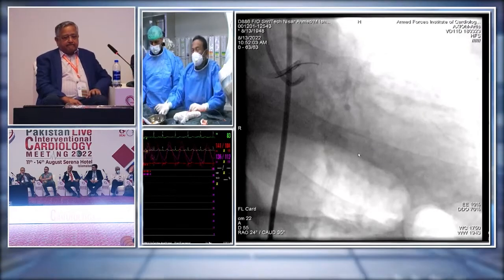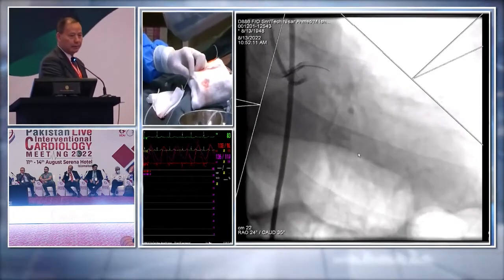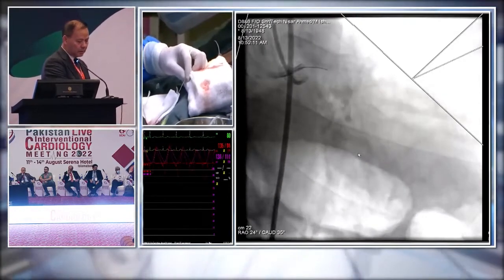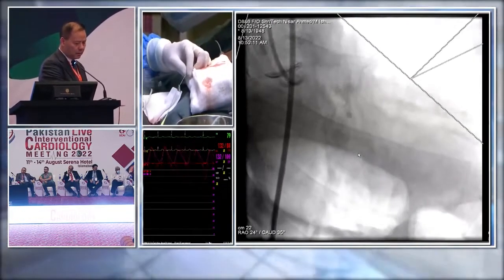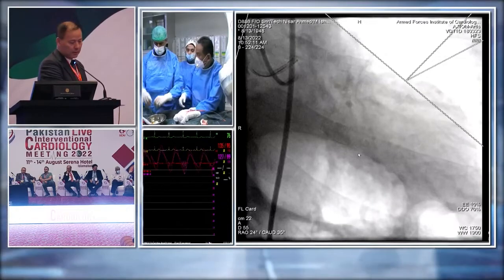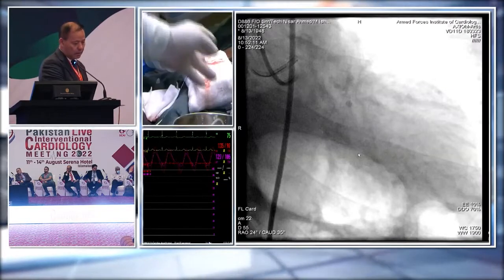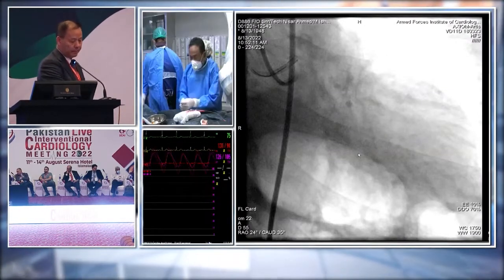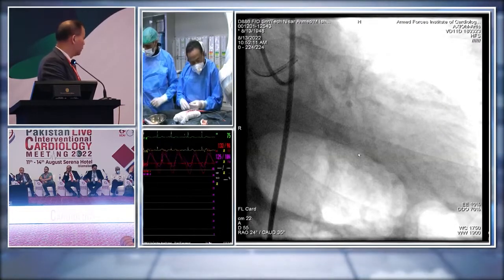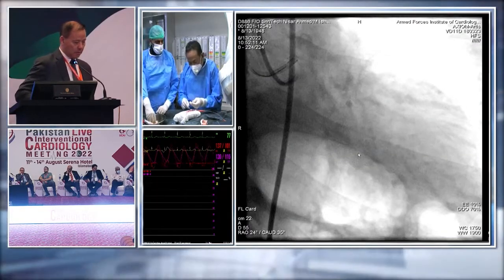Before the procedure, Rosli, can you tell us what the guiding catheter and the first line of wire to use? Yeah, this guide, EBU 3.75. Okay, so what's the wire? So what we did was we got the Fine Cross to go down, and I used a normal standard wire. Which wire is this? What wire are you using? That one was Runthrough Floppy, and I'm going to use a Conquest Pro, and this is 9 grams.